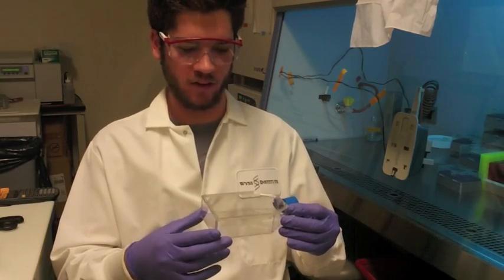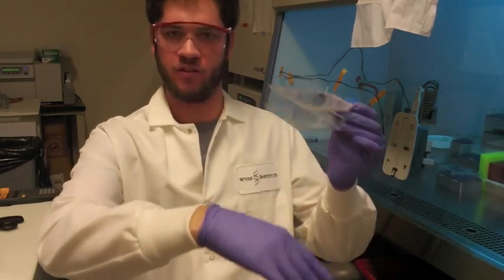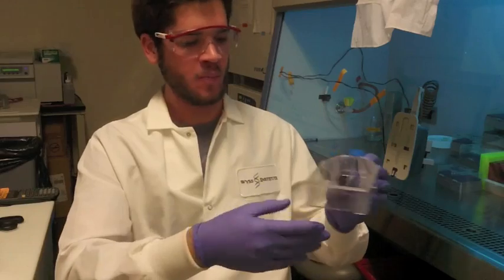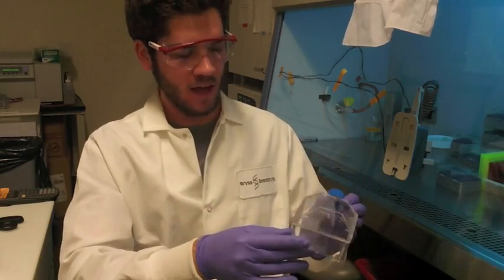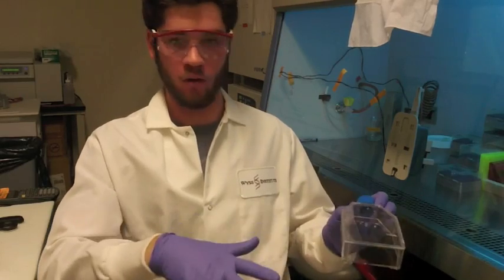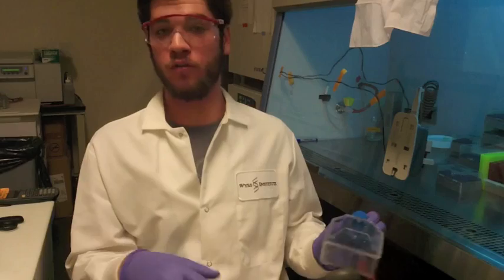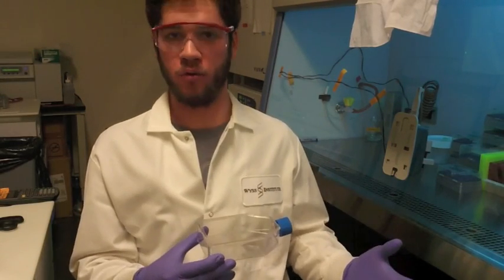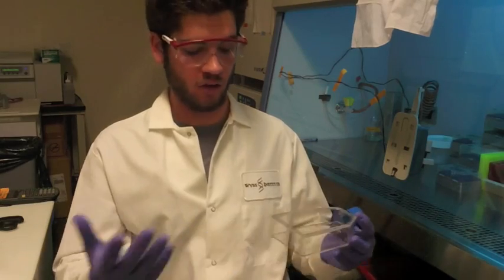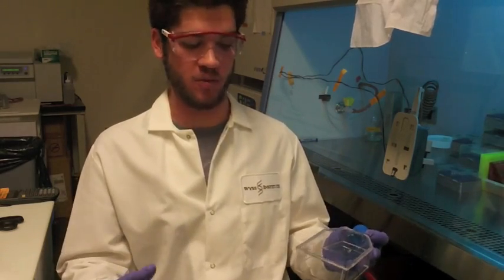So the way this is typically done is you just plate the cells out on the bottom of this flask like this, and you put a layer of media, so just food for the cells, on top, and you let them grow. So they'll grow to cover the bottom of the plate, and in only about 3 or 4 days, they will have grown to the point where they have eaten all the food in the liquid and have released a lot of waste and have no more space to grow. And the cells start to become unhealthy, and they will pretty quickly start dying after that.